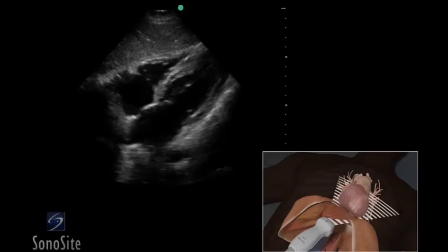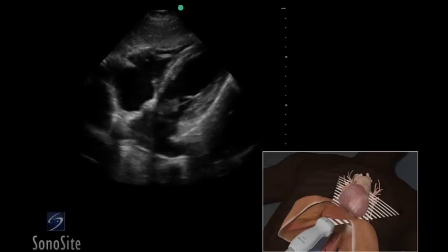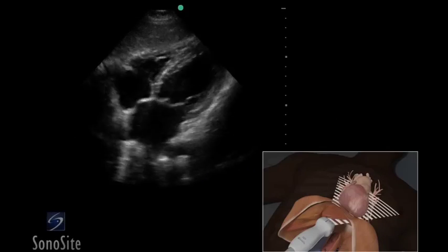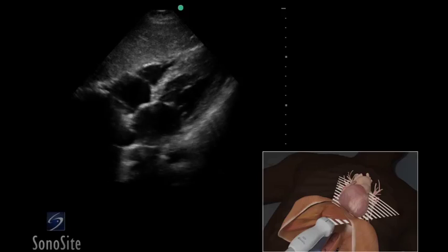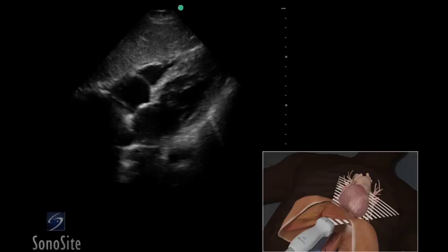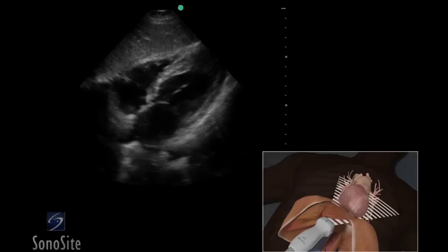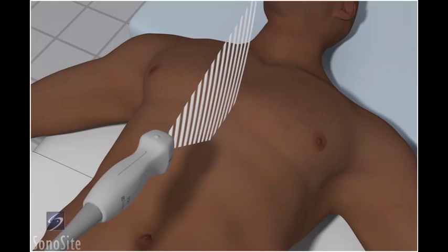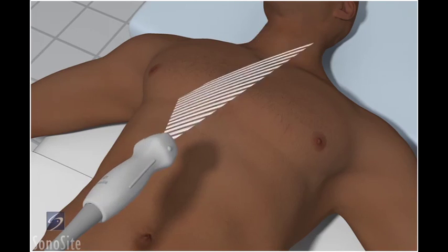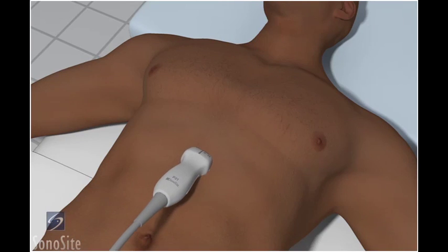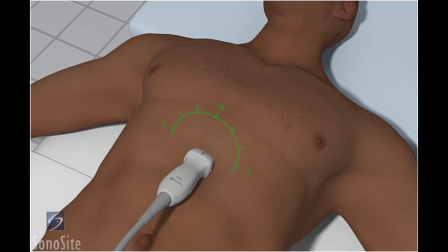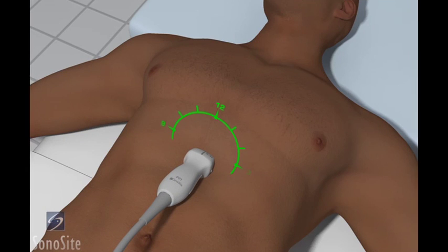A phased array transducer with a cardiac exam type is used to perform the subxiphoid or subcostal view of the heart. Place the transducer in the subxiphoid position with the transducer orientation marker to the patient's left side at a 3 o'clock position.